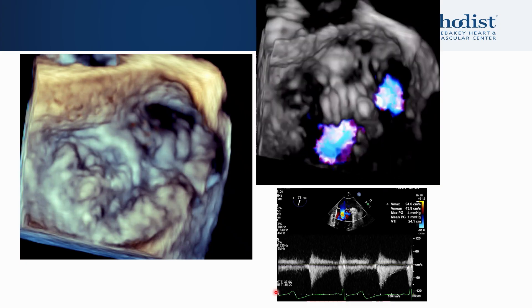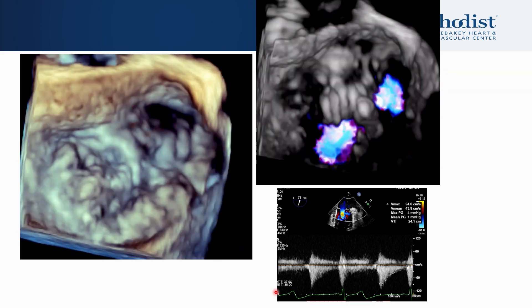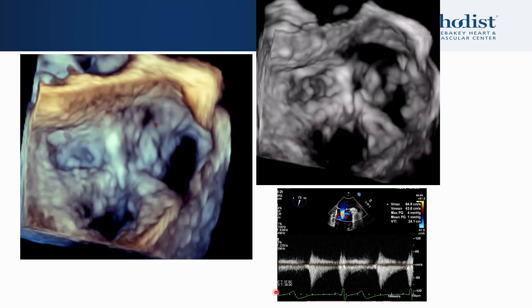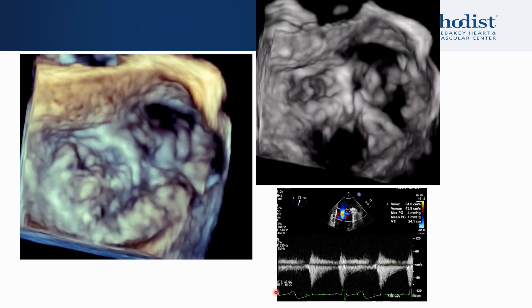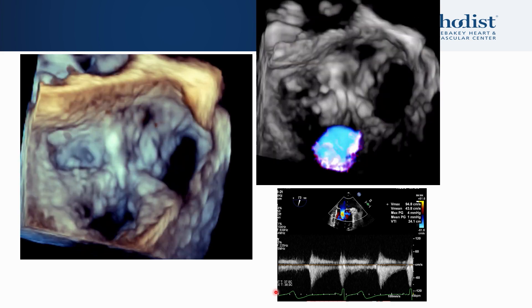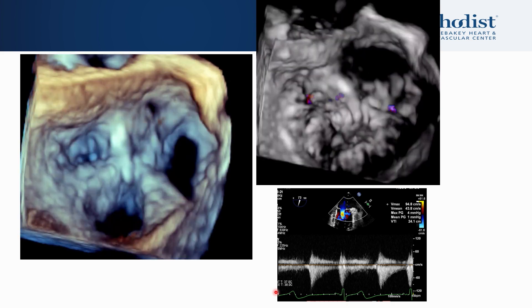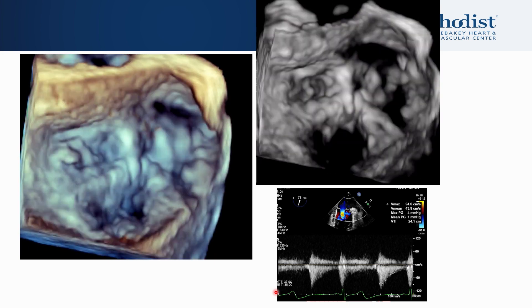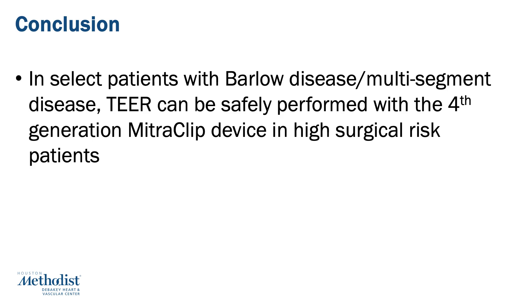The corresponding 2D color images — intercommissural and long axis — show the two clips with very trivial residual mitral regurgitation after two MitraClips have been implanted. The final 3D with and without color after clip release is shown in the top panel, with the mitral gradient on the bottom. Despite two clips, the residual gradient is only 1 mmHg, indicating an excellent result with very trivial residual mitral regurgitation and a negligible gradient across the mitral valve.